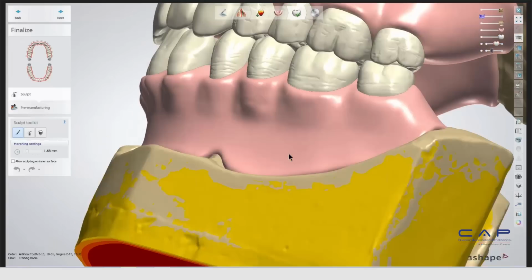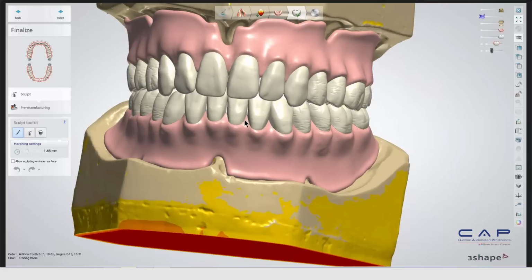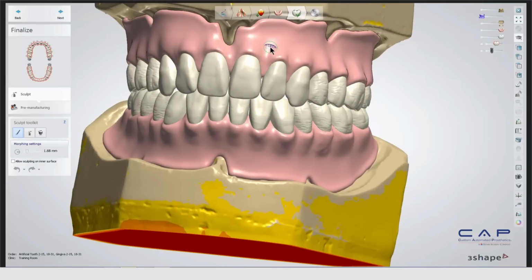But now you can see we have our dentures set up here. So now we can go ahead and do the sculpting, which is just like the gingiva design, where we can go ahead and use the morphing tool to push and pull certain areas, or we can use the wax knife tool to add and smooth certain areas out, or if you wanted to give it a little bit more characteristic, you can smooth it back down. You can do both just by clicking on one or the other, switching back and forth like if you were doing a full mouth case.